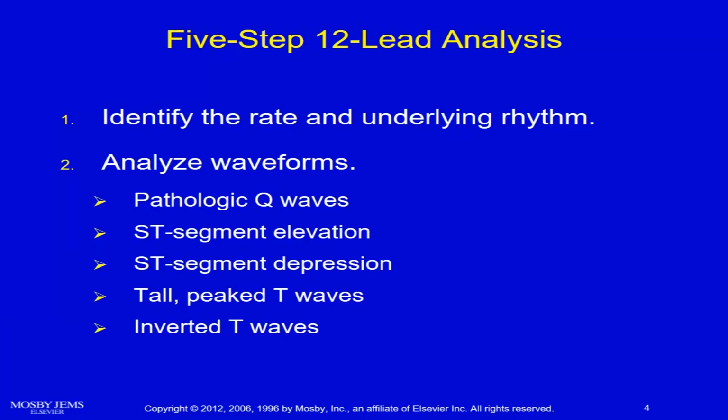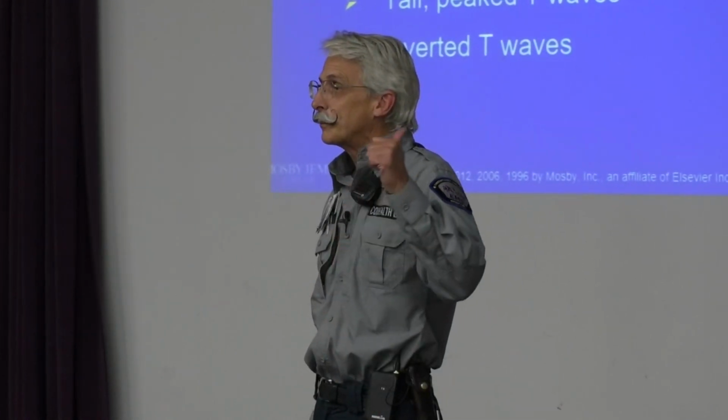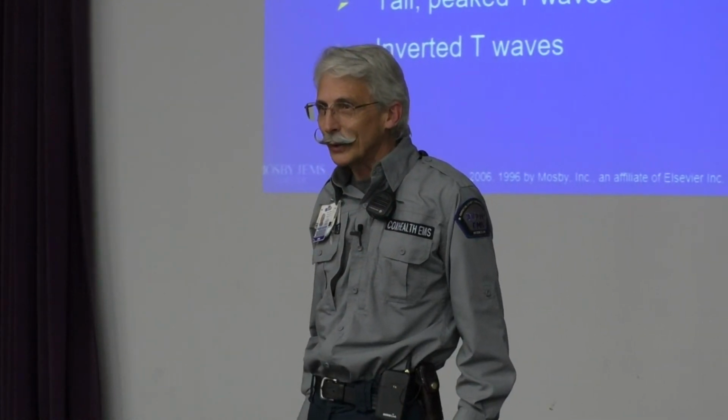Why do we do that? Aren't we looking for ST elevation? Don't we want to know a STEMI? Why are we looking for rate and rhythm? Patients shouldn't die while you're reading their 12 lead.